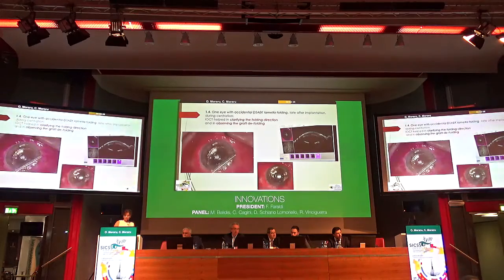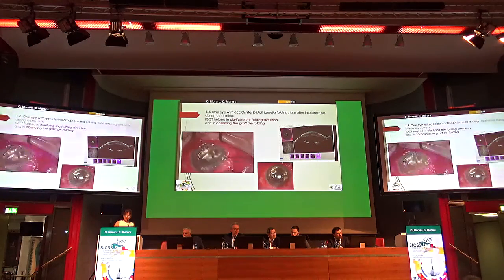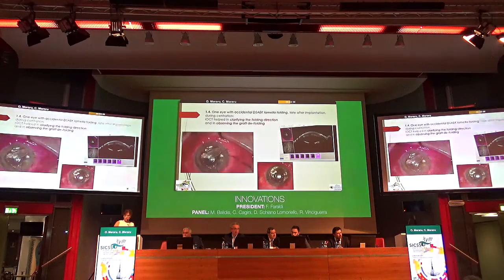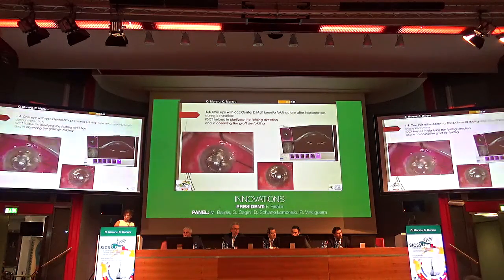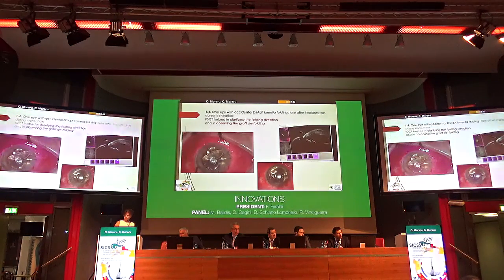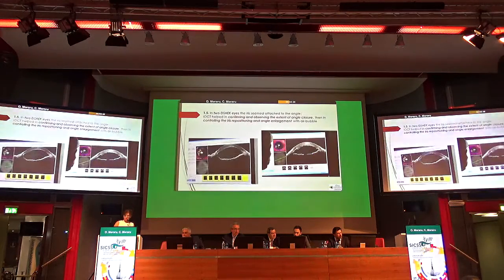Another case, the implantation was absolutely okay. I wanted to center it better with gentle massage, but it seems I was not gentle enough, because look what happened. I asked for the OCT, and again it really helped me visualize in which direction it was folded. At the end, I resolved it as in my first case.